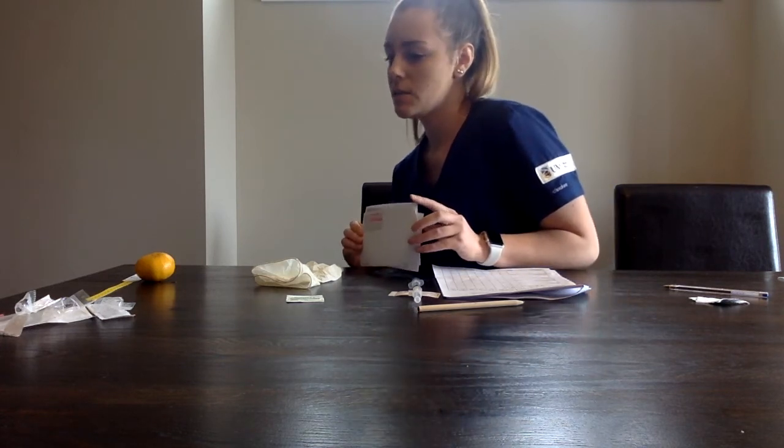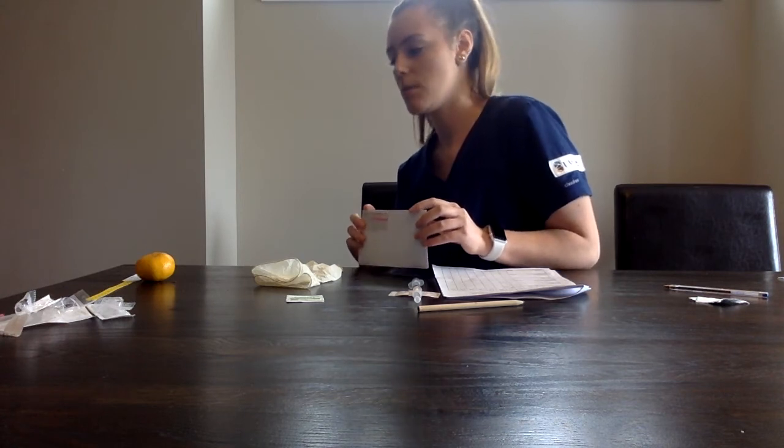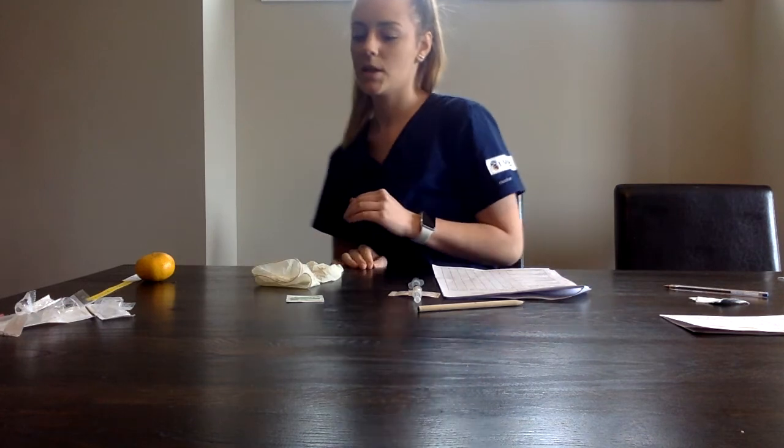We'll be continuing to monitor your vital signs and pain levels after we administer this drug as well, just to make sure it's been effective and to make sure that your condition is remaining stable. Jake, do you have any questions about this medication? Is it okay if we give it to you? Okay, so Jake has given us consent. We can go ahead with administering this medication.